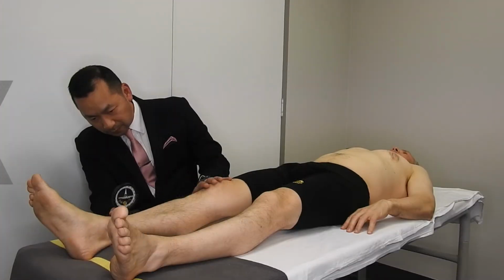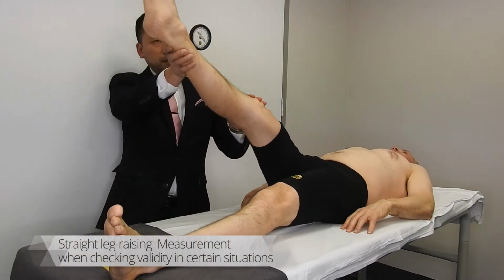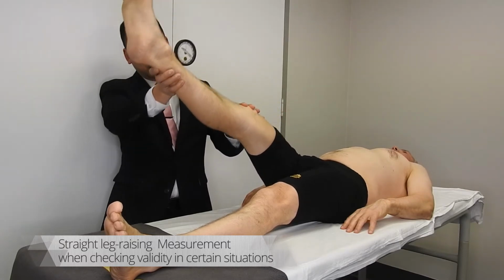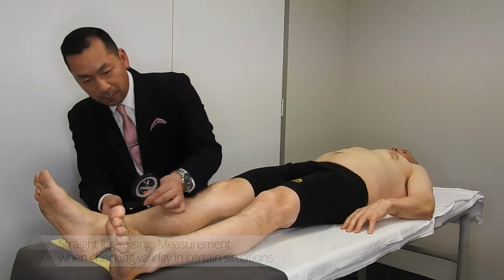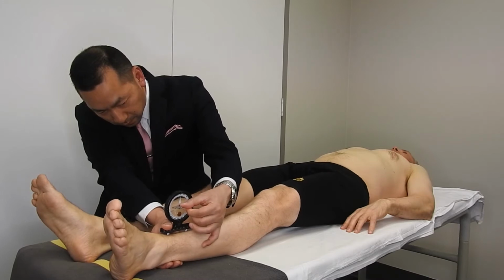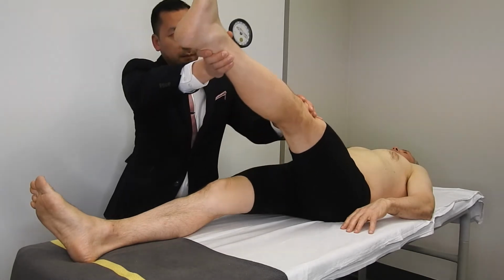A validity test may be undertaken, measuring the tightest straight leg raise in either limb. The tightest SLR should not be more than 15 degrees greater than the sum of the sacral extension and flexion angles. This assumes sacral motion is less than average.